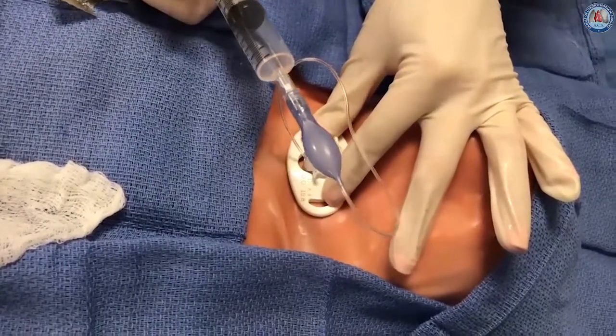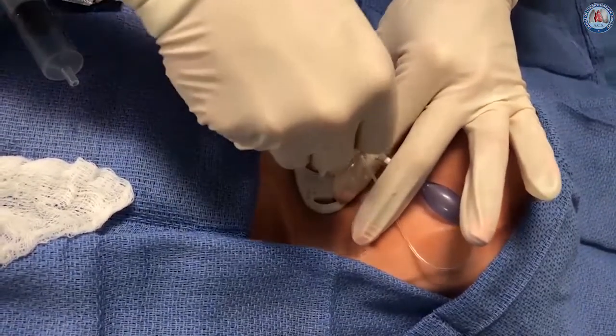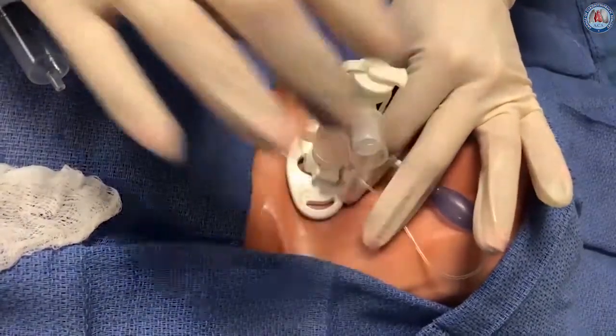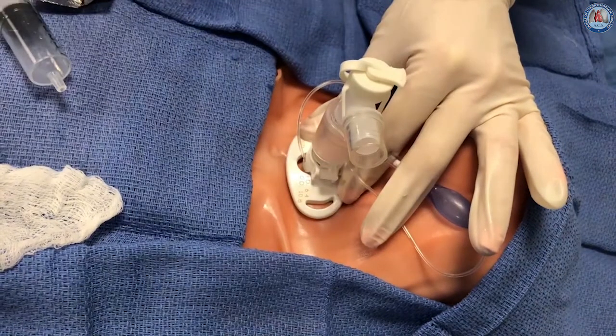The tracheostomy cuff is then inflated. Lastly, the inner cannula is introduced, the tracheostomy adapter is placed for bag mask or mechanical ventilation, and the tracheostomy is secured with sutures or a soft collar.